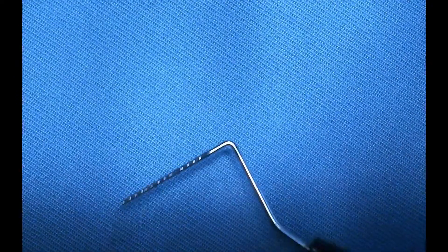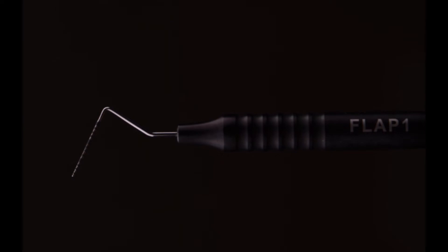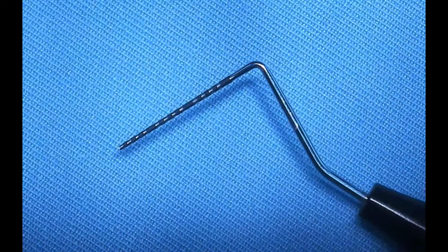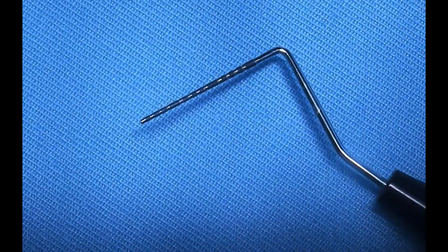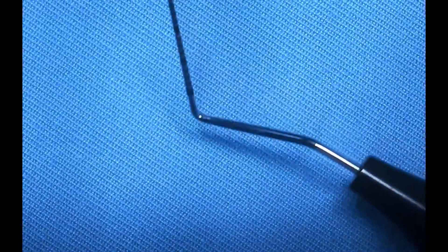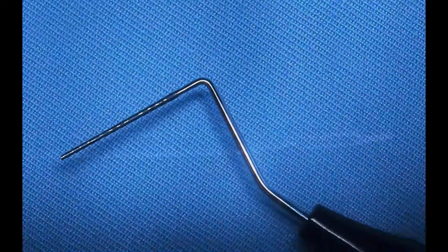I use the probe to make some final adjustments in my flap design, or maybe rethink it just before I make the incision. As you know, incisions are irreversible. Besides outlining, you also need a probe in your surgical kit to measure things — a donor site, a recipient site, a defect size, to actually probe and confirm a root fracture, etc.